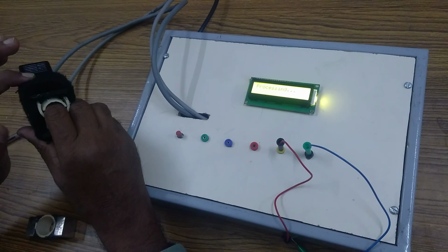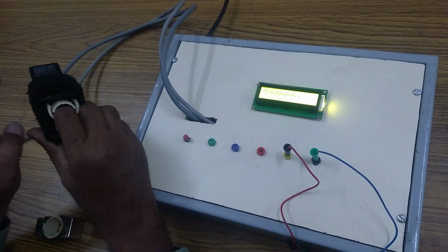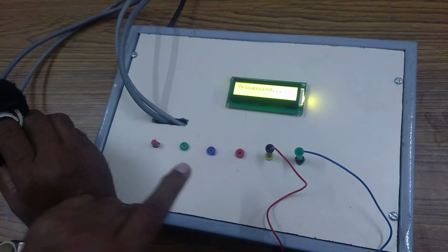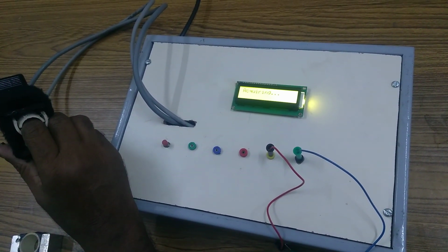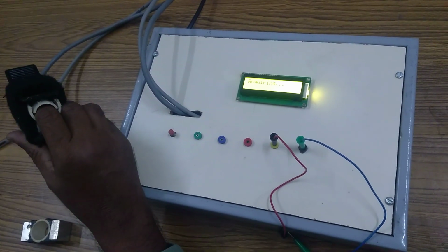So here I put my finger, and the different absorptions are taken, and then processing is going on.